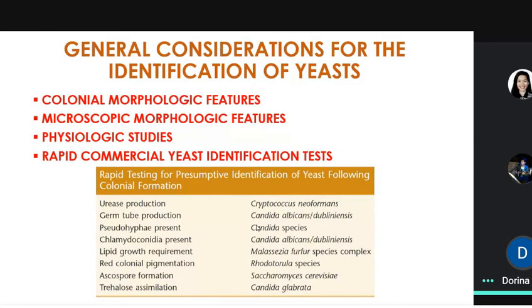So, for our yeast, again, you take on to the colonial morphologic features. Ano ba ang colonial morphologic features ni yeast? Diba sabi natin, ito lang yung bibigay ng kapareho ng bacteria where you will see the mucoid colonies din. Kaya napagkakamalan din usually na bacterial colony. Then we get into the microscopic morphologic features. Ano ang microscopic morphologic features ng yeast? Ano usually makikita nyo?